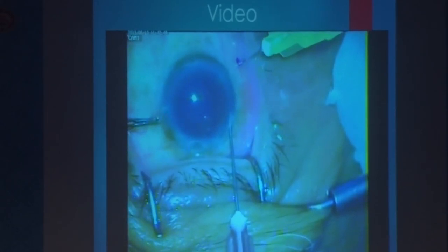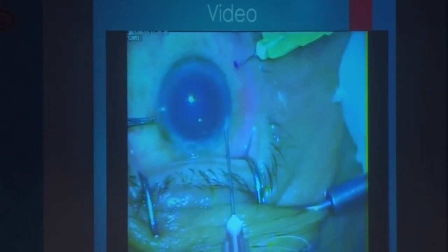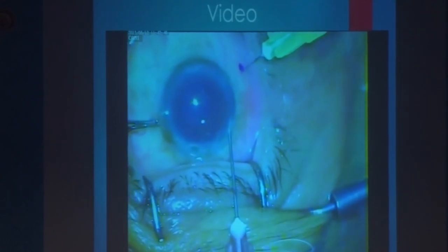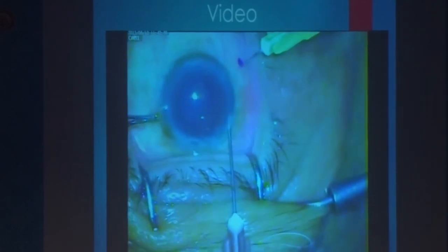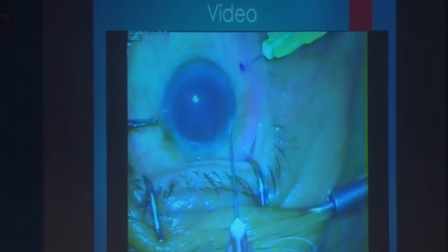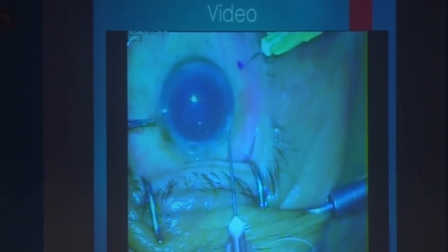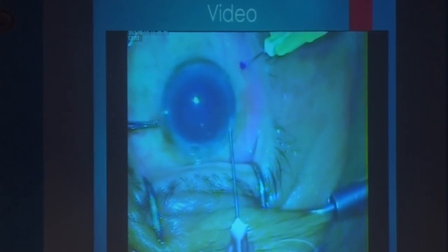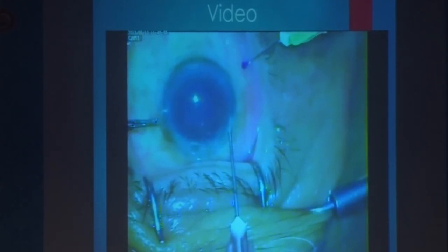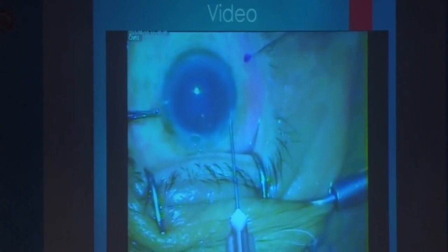The reason a Johnson Bud is used rather than a bare needle is that if you use a bare needle directly, it will reduce the pressure, and in a hypotonus eye it is difficult to give intravitreal injection. So the Johnson Bud acts as a guard for the inner opening.